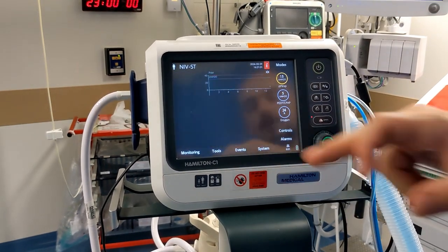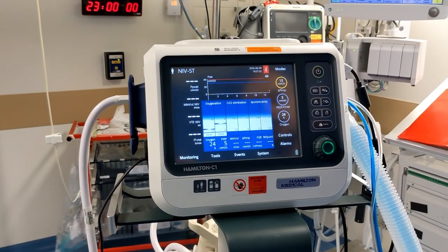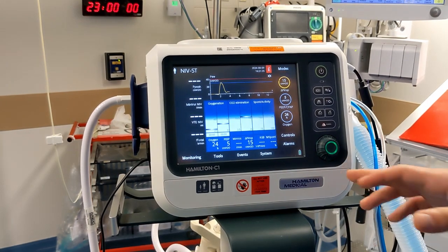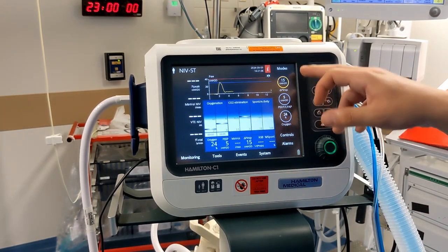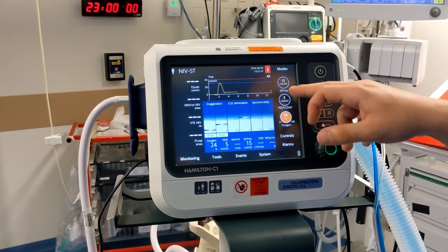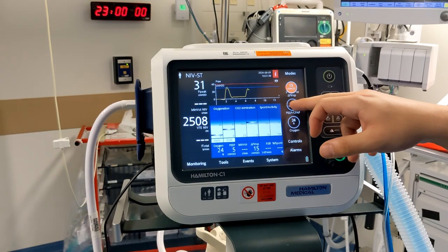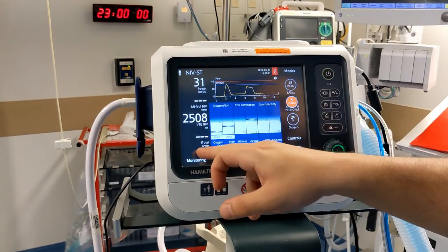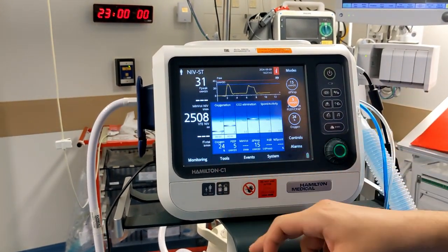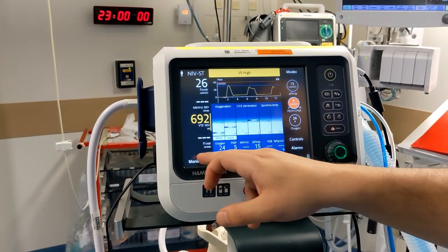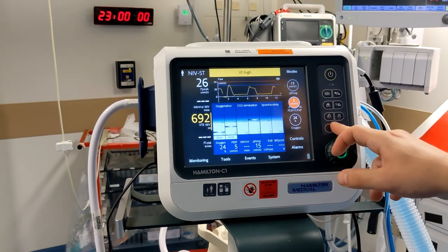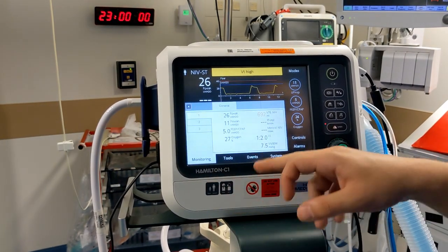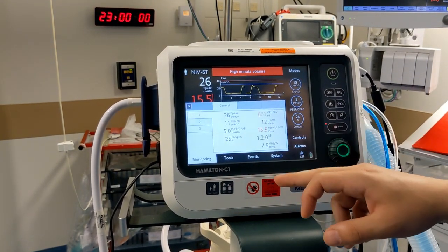Then you press Start Ventilation. Looking at the screen you can change everything — oxygen, inspiratory and expiratory — while it is working. Here you will see your tidal volumes. If you click on Monitoring you will have all of your settings displayed.